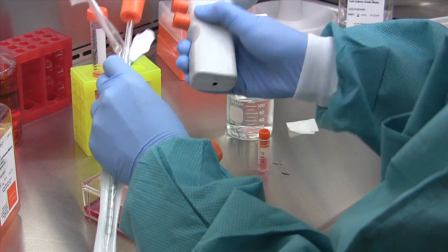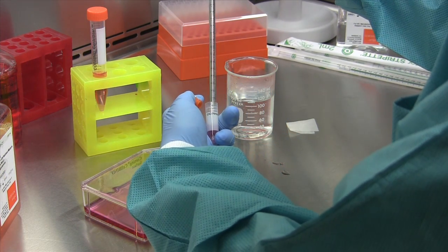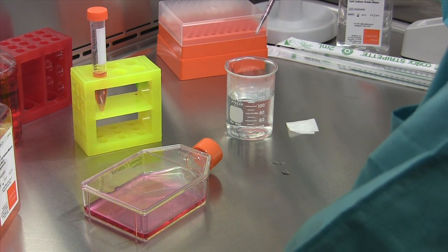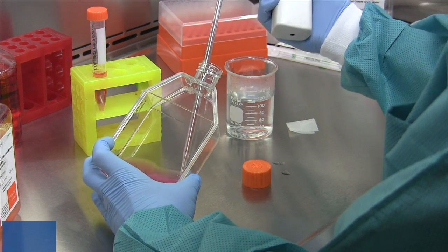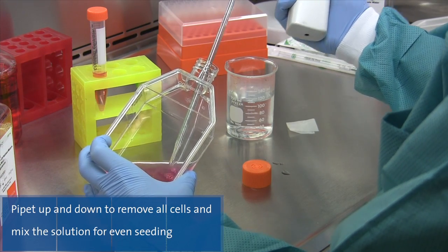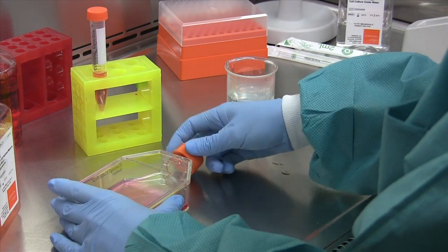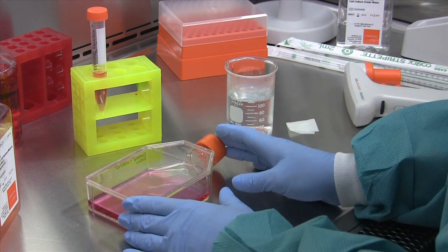You will then want to carefully remove the cells from the cryovial and transfer the cells to a T75 flask containing your pre-equilibrated media. Once the cells have been transferred, you have successfully thawed out your cells and the flask is ready to go in the incubator.